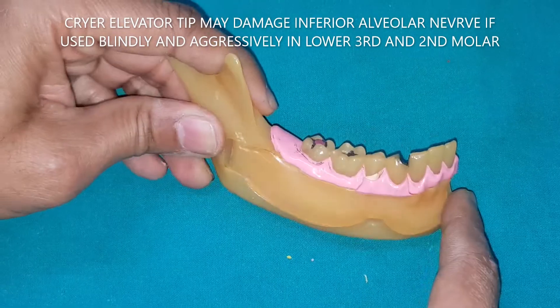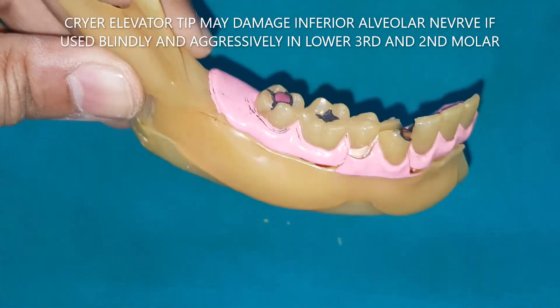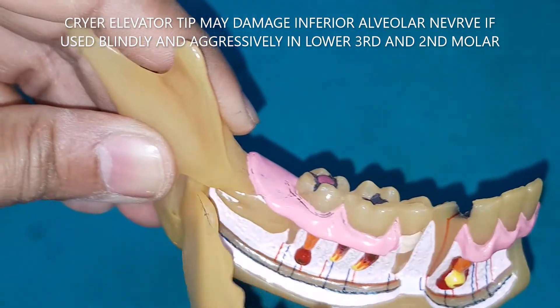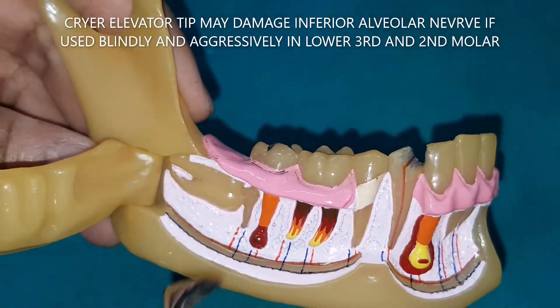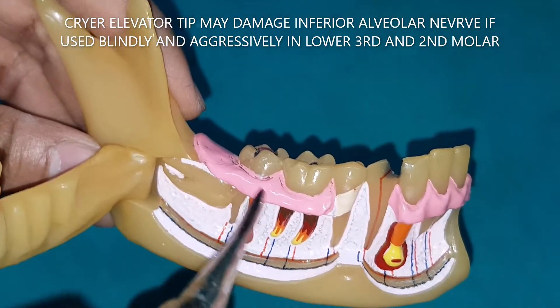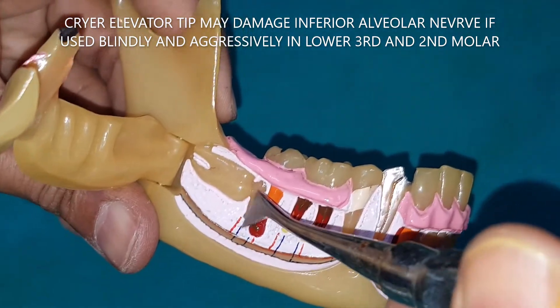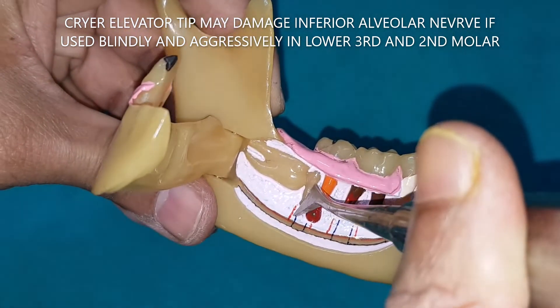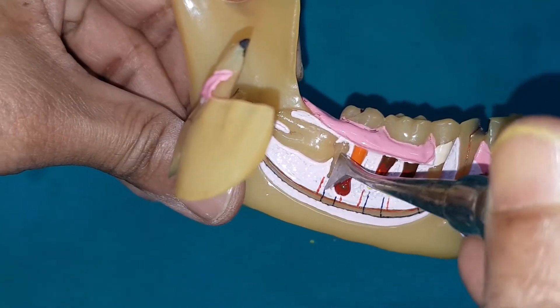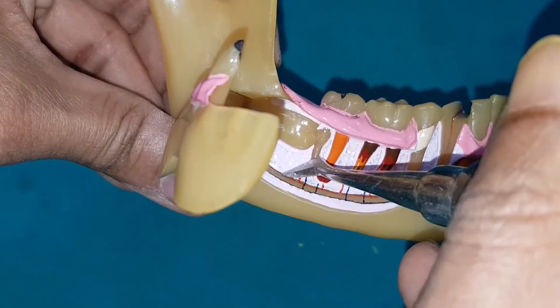If you want to use the Cryer elevator in the lower third molar or second molar region, be very careful — the inferior alveolar nerve lies very close to the roots of the second and sometimes third molar. If you go too deep blindly, the sharp tip of the Cryer elevator may damage the inferior alveolar nerve. Never use it like this.